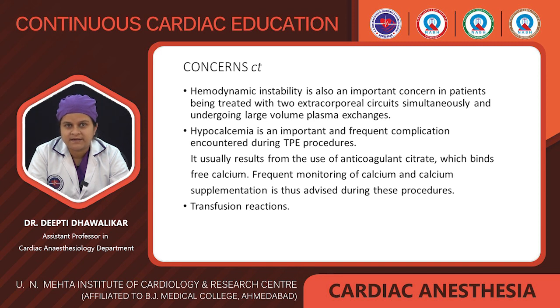Second is hemodynamic instability, which is also an important concern in patients being treated with two extracorporeal circuits simultaneously and undergoing large volume plasma exchanges. Third is hypocalcemia, which is a very important and very frequent complication encountered during TPE procedures. It usually results from the use of anticoagulant citrate, which binds to free calcium. Frequent monitoring of calcium and calcium supplementation is thus advised during these procedures. And last concern is transfusion reactions. These patients are already in multisystem organ failure and are immunologically dysfunctional, so there are very high chances of transfusion reactions in them.